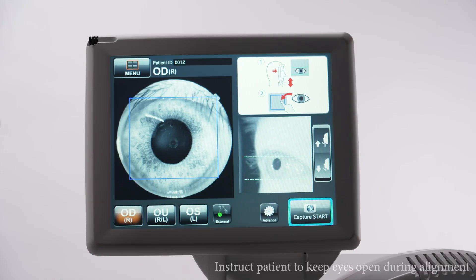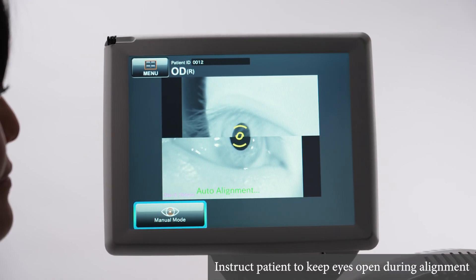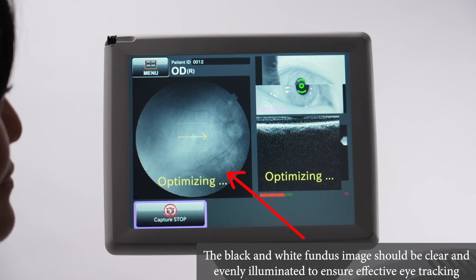Instruct the patient to look at the green fixation target inside the camera. Press Capture Start and the device will automatically align, focus, and optimize.